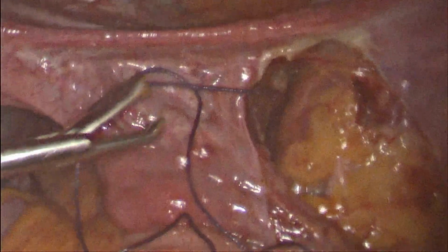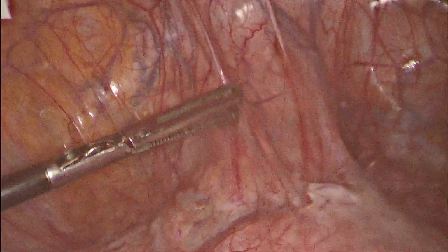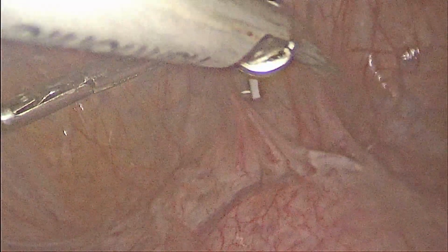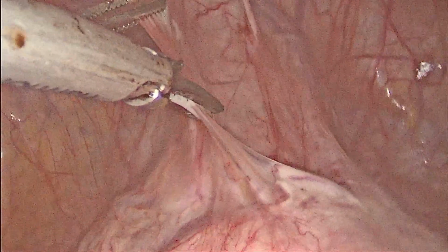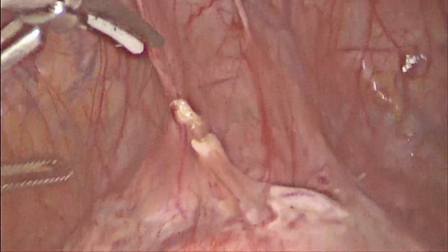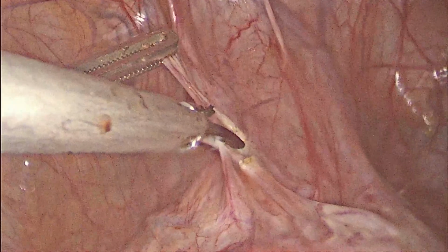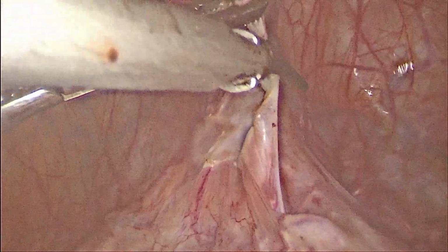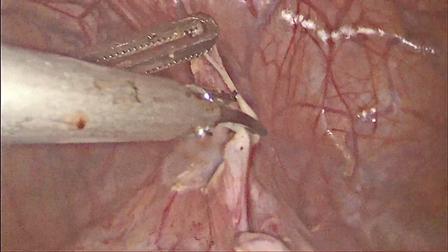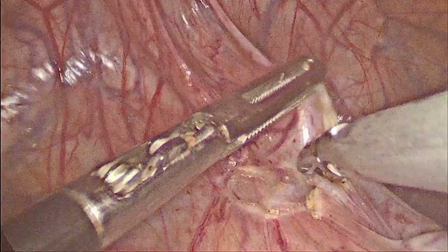Here, while tightening the knot, care should be taken that we do not overshoot. So now we will try to separate the uterovesical fold of peritoneum away from the cervix. Here we need to remove all the contents of the scar pregnancy and excise the scar area and approximate the ends. So for this we need a little longer dissection than we routinely do for a hysterectomy.